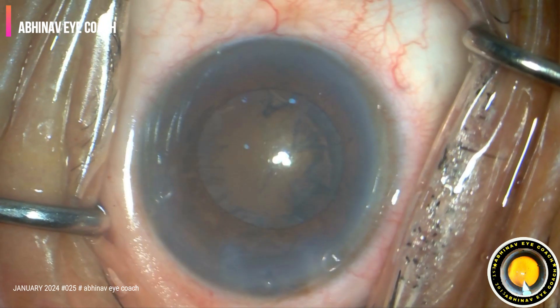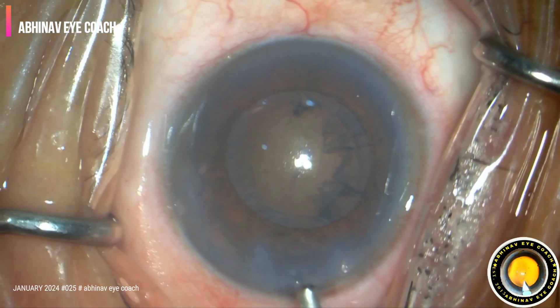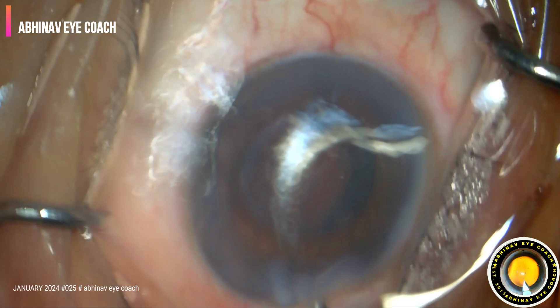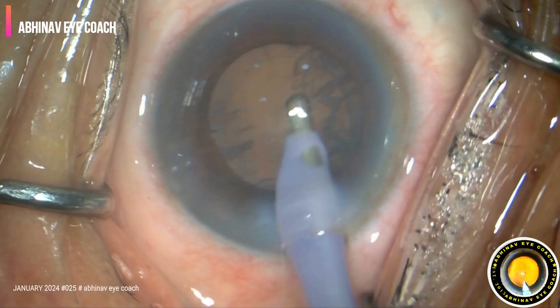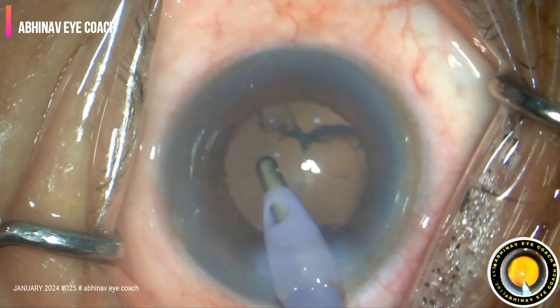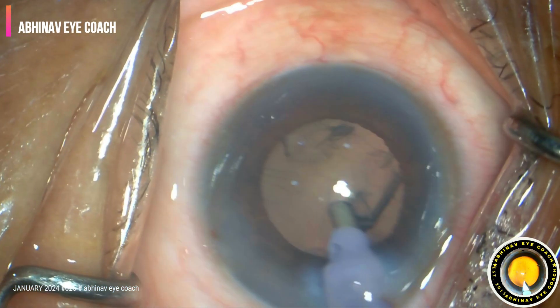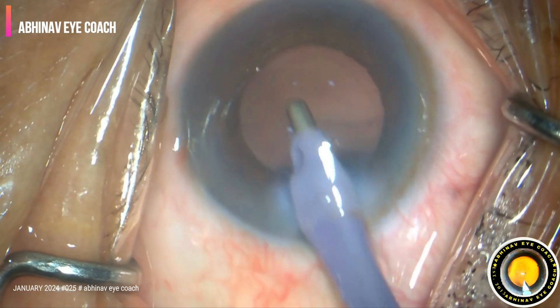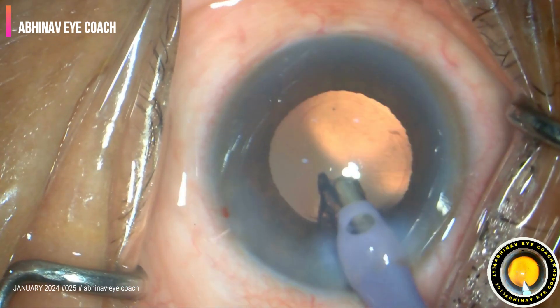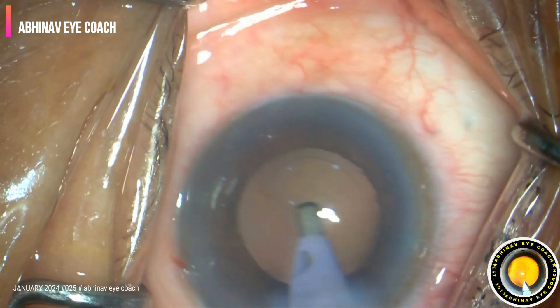Now waiting for irrigation and aspiration — coaxial irrigation and aspiration. First, as usual, the cortex is loosened from all four quadrants. Then the whole sheet of cortex is aspirated. Sub-incisional cortex is removed very carefully.